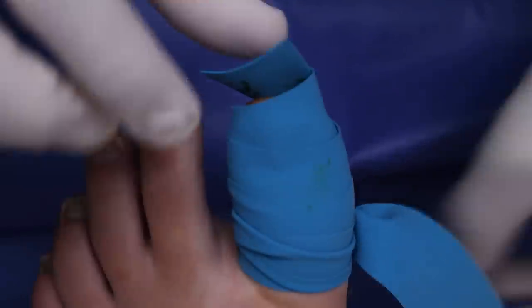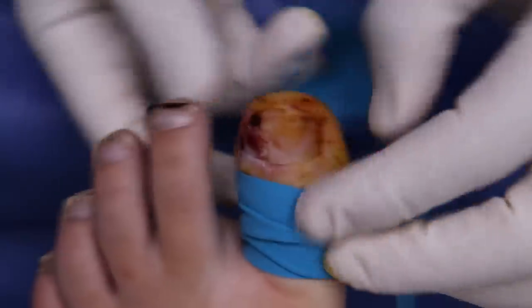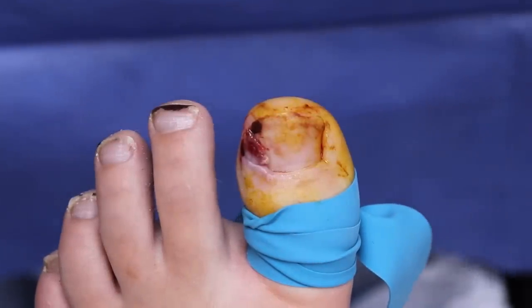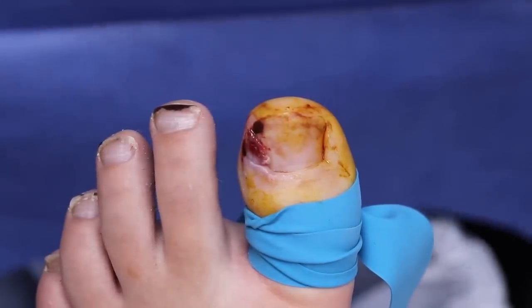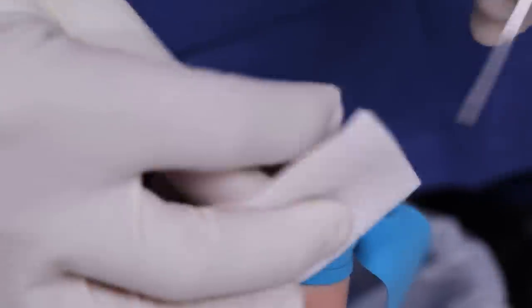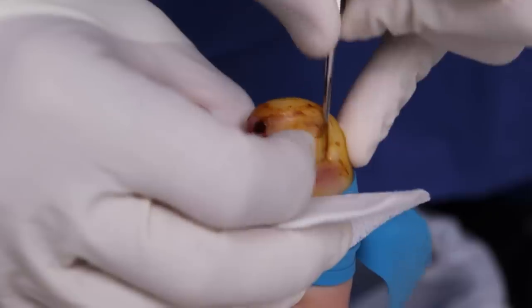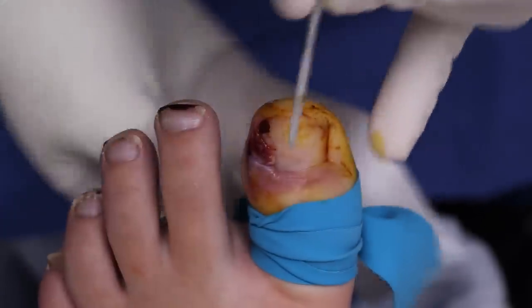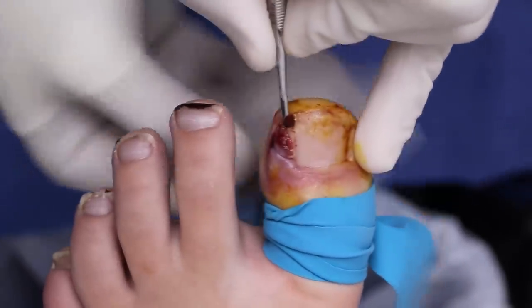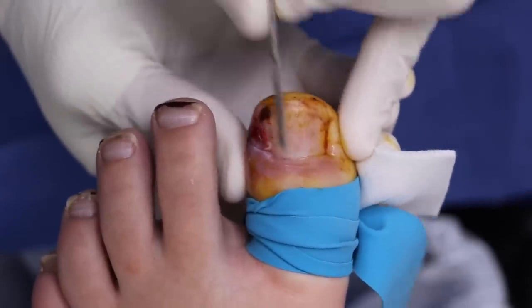We'll do our second check in a moment — pressure is completely normal, nothing sharp. It's been a while since I had a tricky toe to numb, but it's about finding that nerve. I'm going to cover this area up and just give it a little poke — anything sharp here? No. Anything down here? No. Perfect. Anything here? No. Down here? No. Awesome.